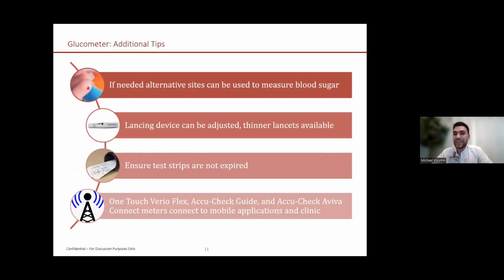So everything in the healthcare world expires. Anything from test strips to things that are even non-medicine, everything has an expiration date. So they're only calibrated for a certain amount of time, essentially. So the company can only guarantee that the reading the test strip is providing with the meter is only accurate if the test strips are within date. Usually it's a pretty long time, like a year or so. You should run out really, if you're testing regularly, before the expiration date occurs.